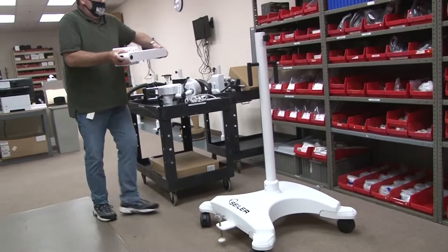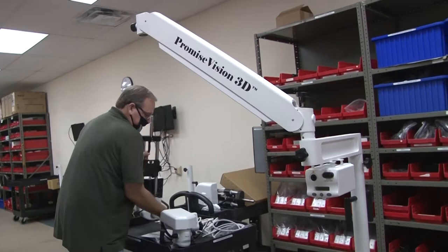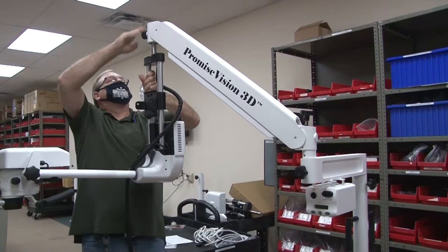Add the power arm and your panto arm, then the microscope. Lock it down.